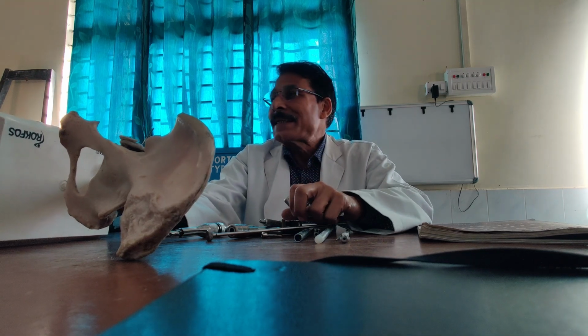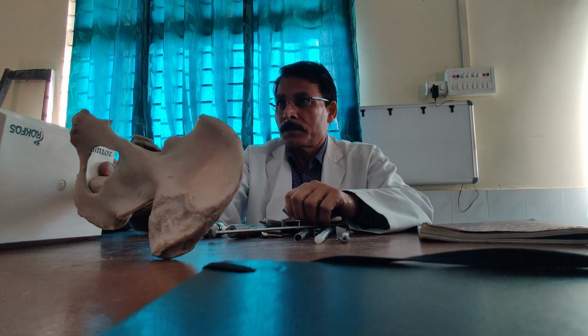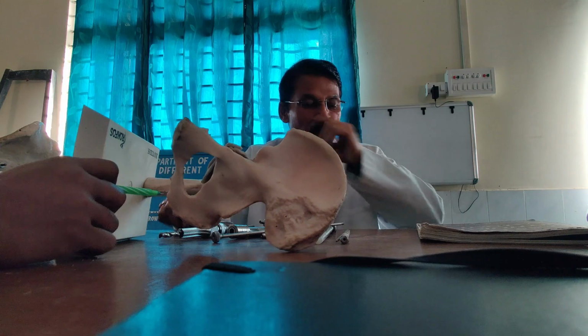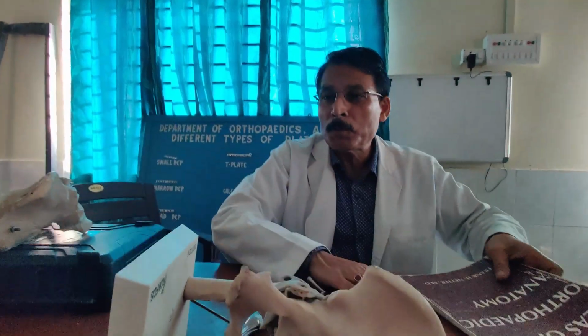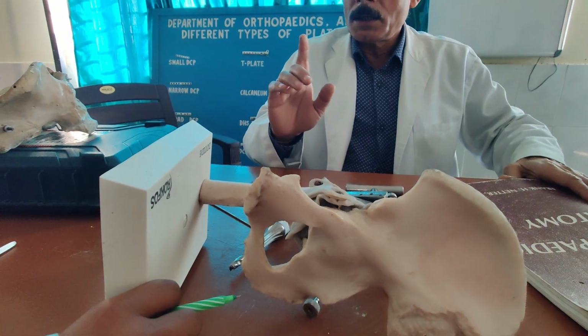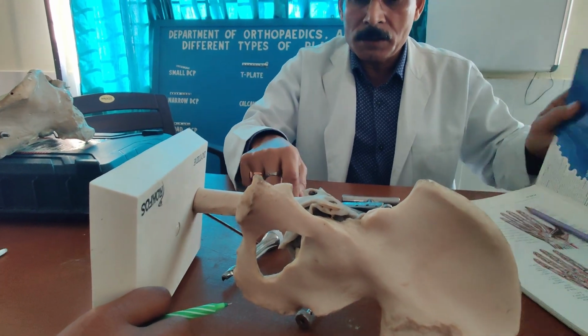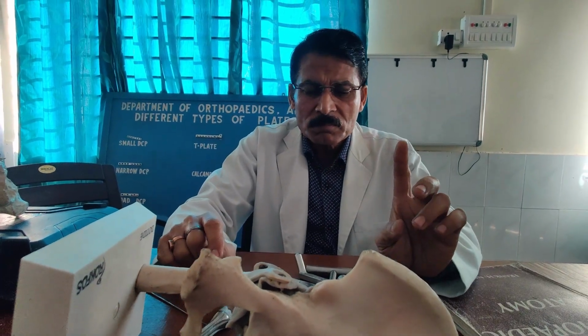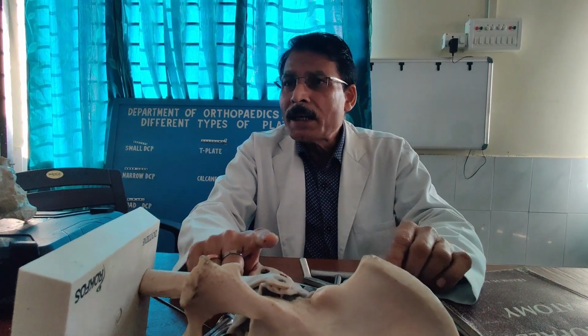So the patient is in the supine position like this. Patient is in supine position, neutral. There are a few more things I am supposed to tell you. One or two things is that the reduction is a must.